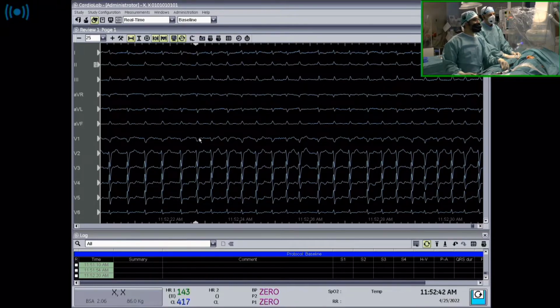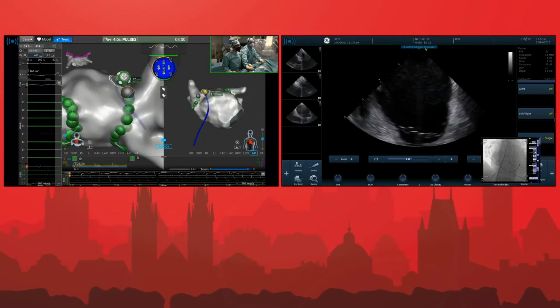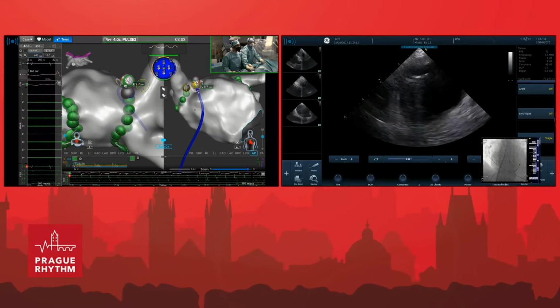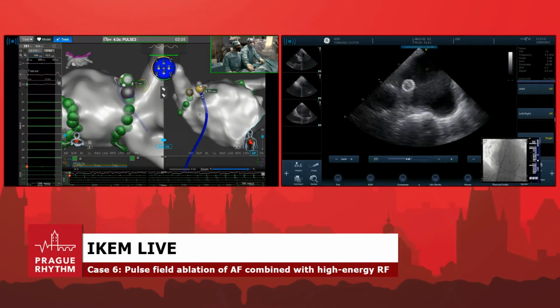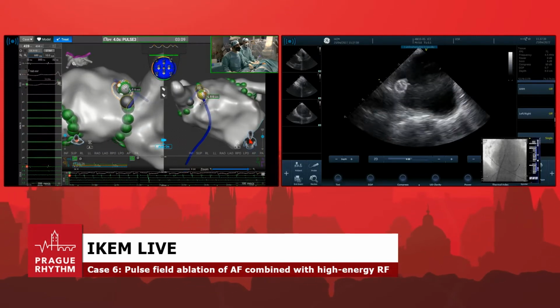Maybe wait. Can we see the posterior wall? So it was a transient event which lasted about 3 minutes, but then it's real. So probably a spasm or something. What about there, Wojtek? Let me see. That looks like a gap area.